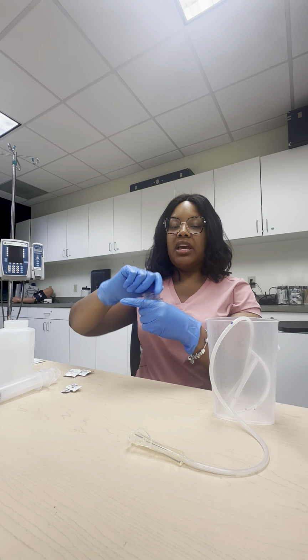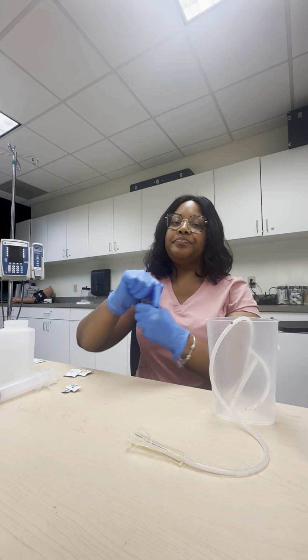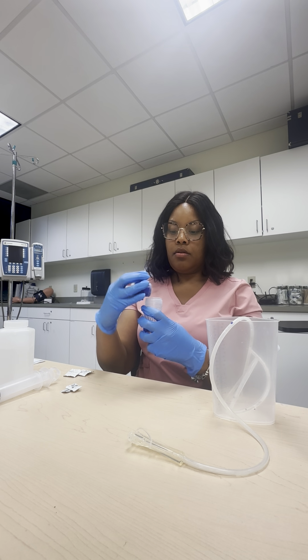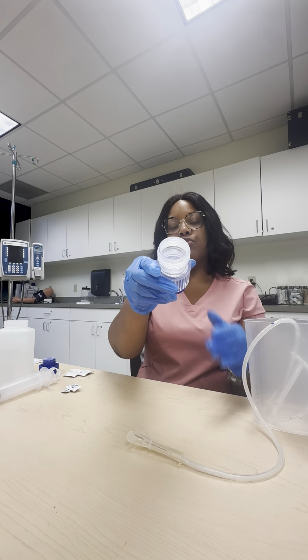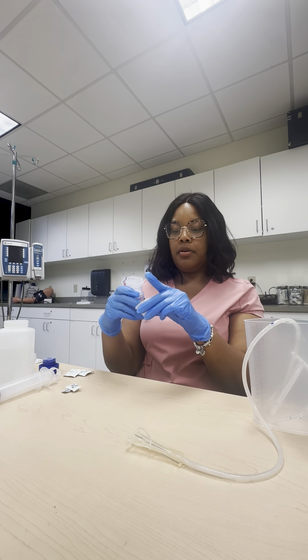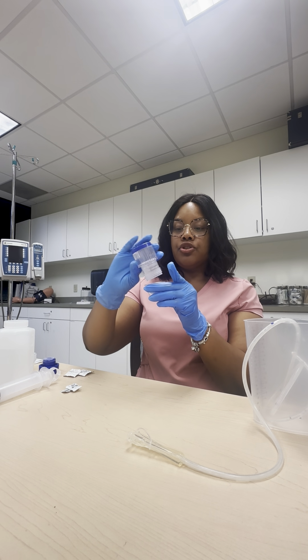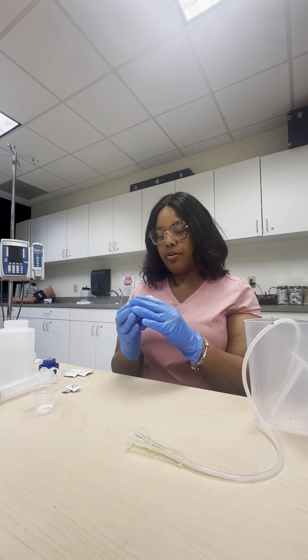So we just put the medication in here and just turn. And as you can see, we got all the lumps out. We want just fine powder. So we're going to take our medicine cup and we're going to dump it in here. So you want to make sure that you get all the medication out of here, okay?